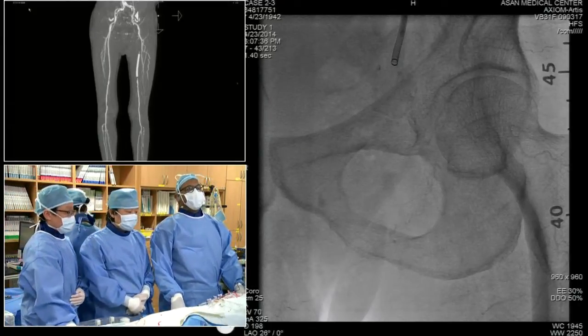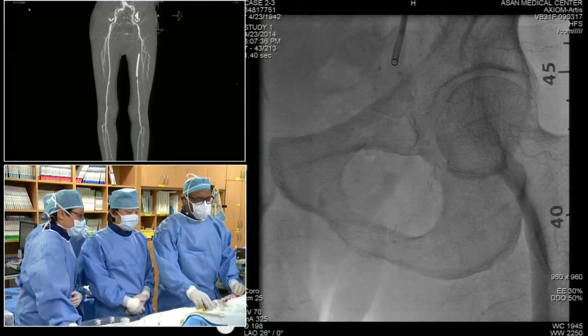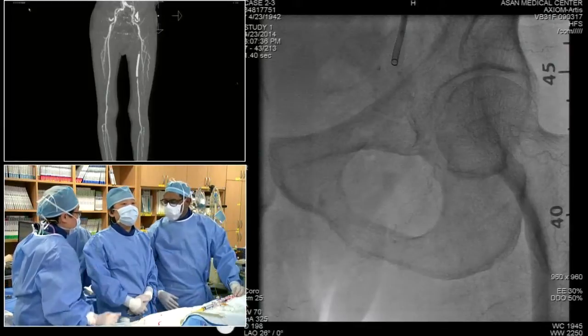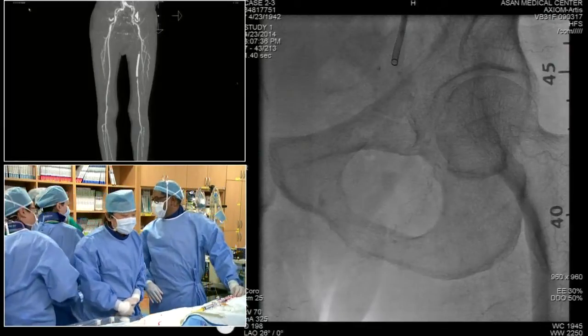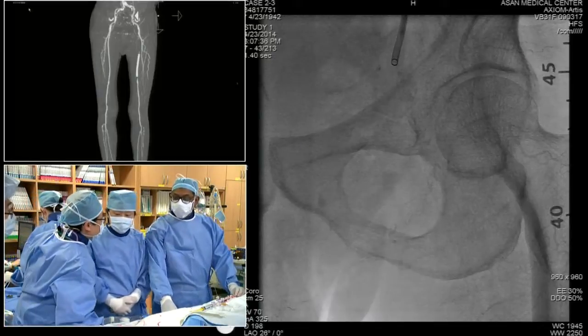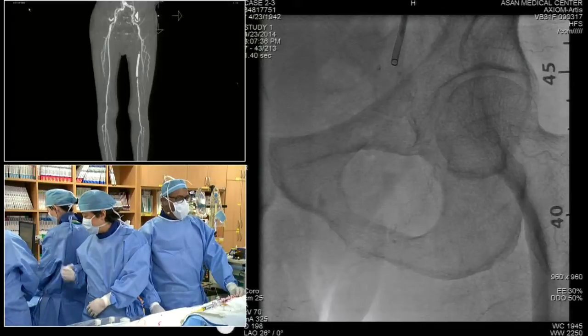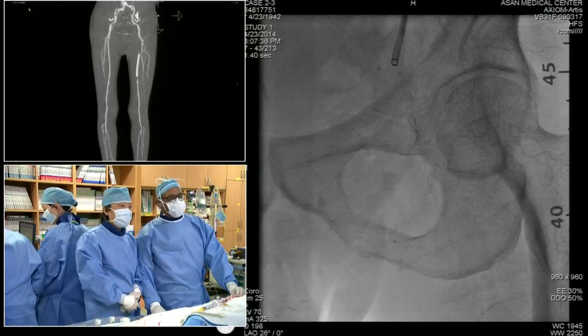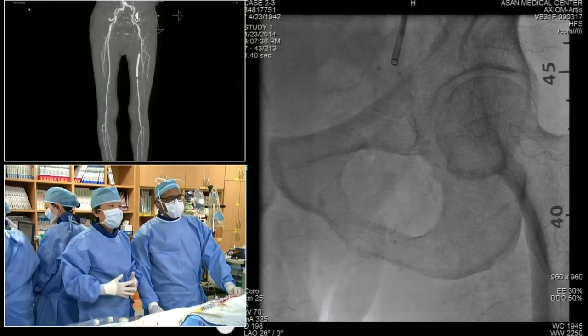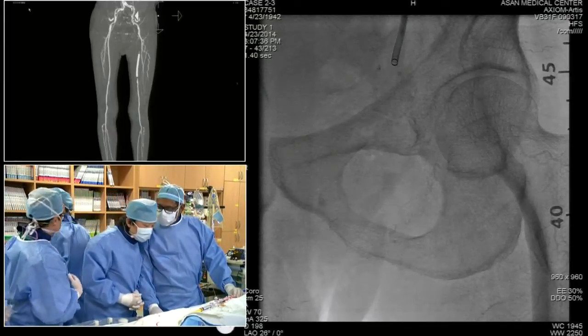I think this is a particularly challenging case because we don't know where that stent wire is, whether it's subintimal. We have a torquer ready. Which wire do you want? A .035 glide wire, extra stiff angle. In cases of long SFA, we'll get into the vessel and then we'll work in the straight AP. How does that sound to you?